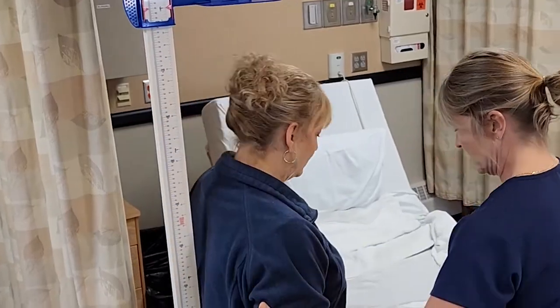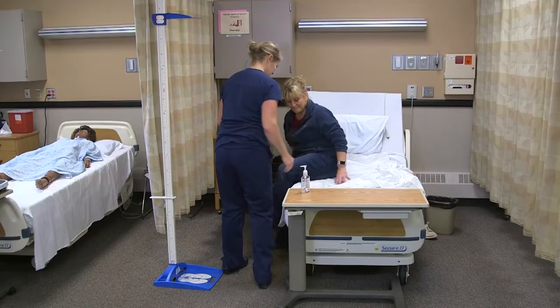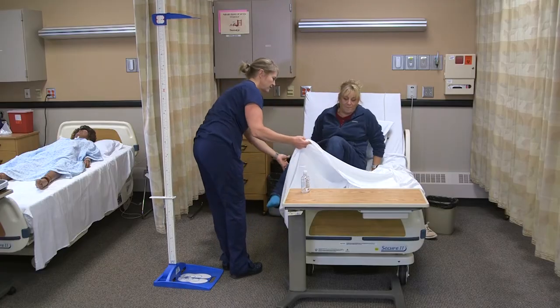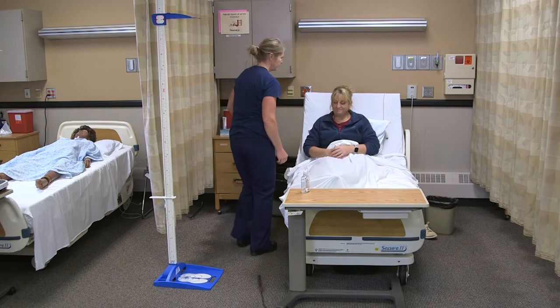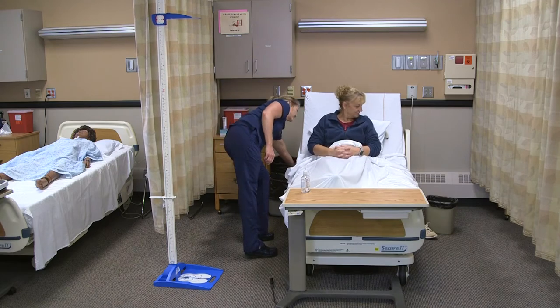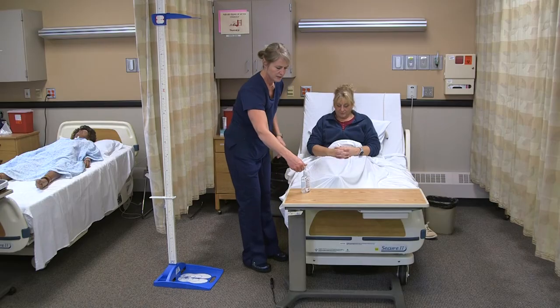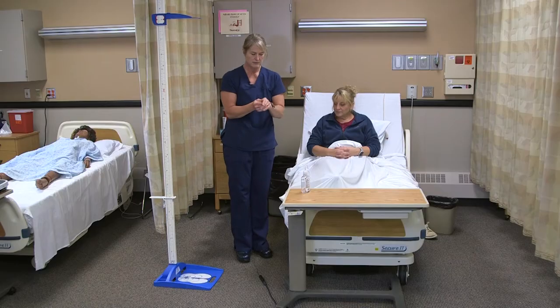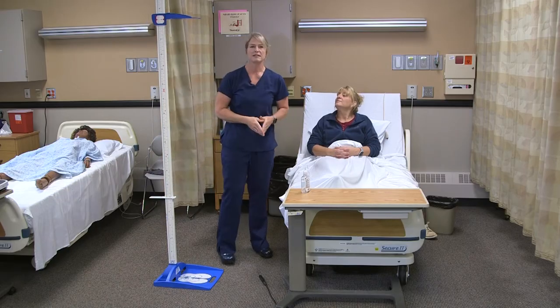I'll move that back up. Let's get you back in bed. Swing your legs in. Are you comfortable? I see you have your call light. I'll check that the bed is lowered again and the brakes are locked. I'm going to wash my hands, open up the curtain again, and then document the height.